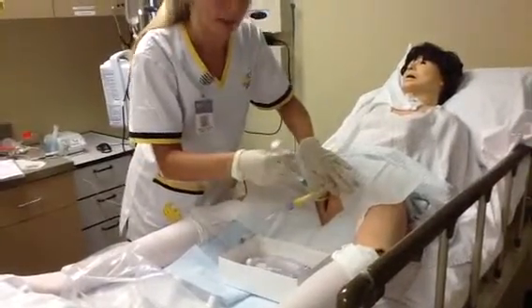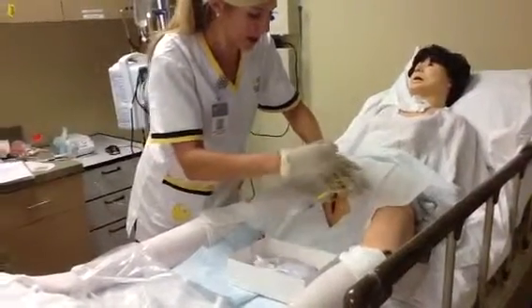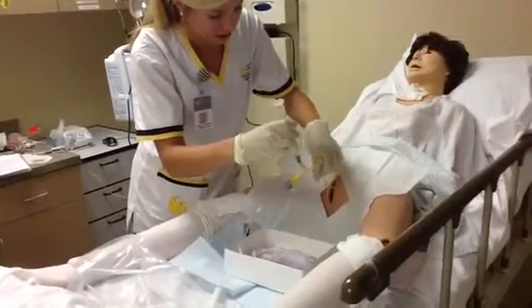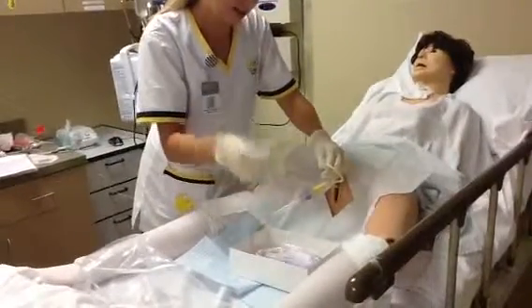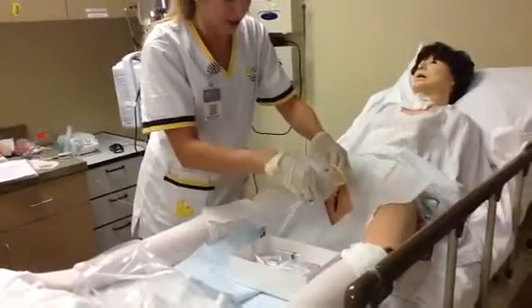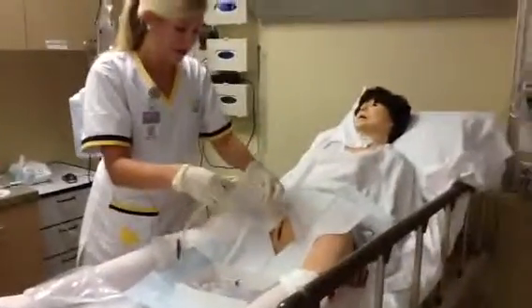Okay, now I'm done with that. So I'm going to go ahead and unhook. I'm going to tug, make sure that stays in there, and I'm going to unattach this. Done with this, now I'm done with my sterile procedure, so I can take this off.